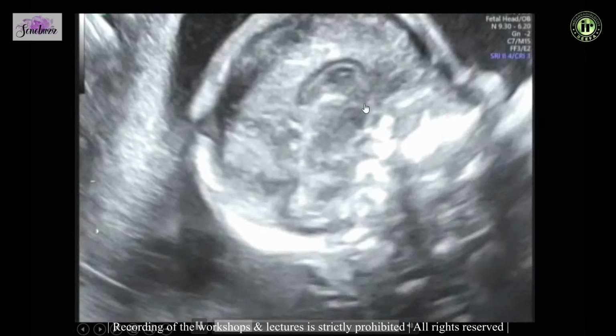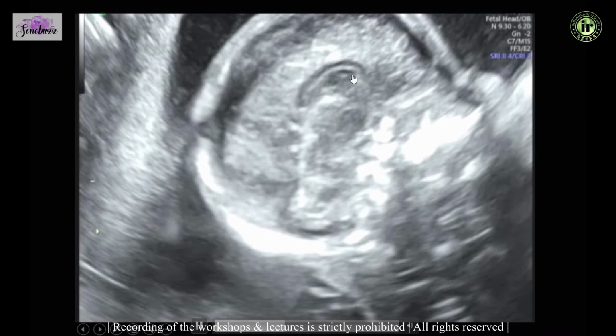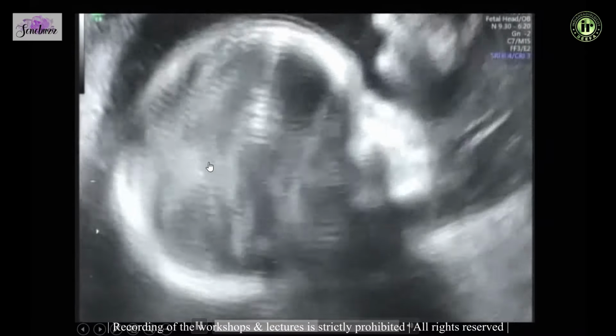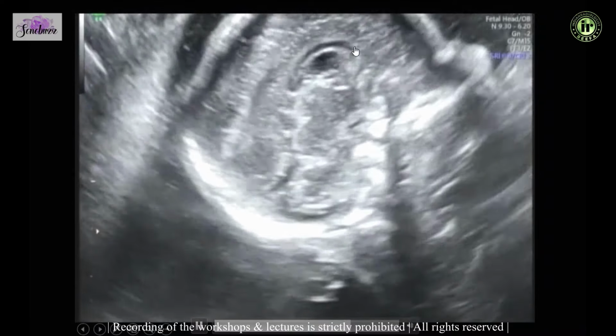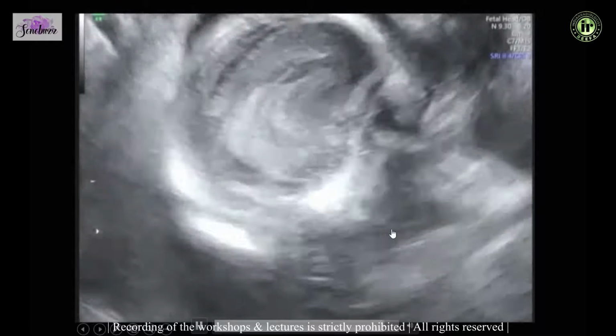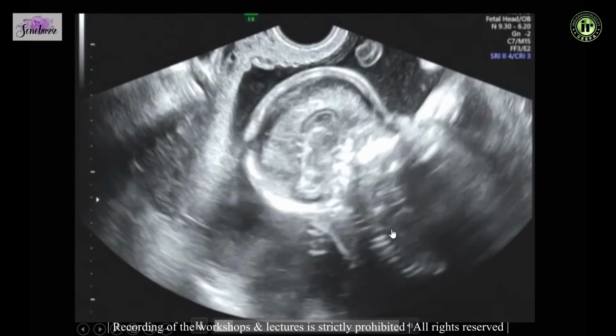So we use both hands, one hand for the transducer, the other hand to move the fetus into the view. You can see that this is a fetus lying deep, and with the hand you move the fetus into position, and you can see the corpus callosum and the cerebellum. So it is very useful and important to use both hands when you scan and do an advanced neurosonogram.